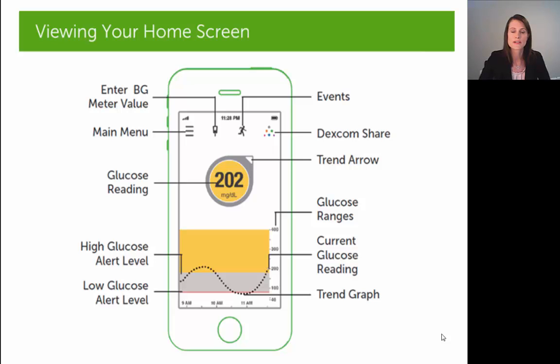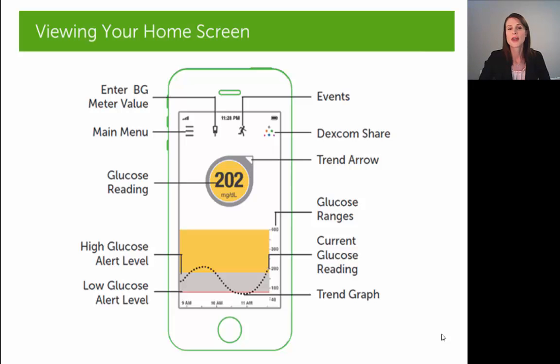In the upper left-hand corner of the G5 app you have three dashed lines representing your main menu, where you can access settings and alerts. Next to that is your glucometer icon, which you tap whenever you want to enter a calibration into your Dexcom system. Next to that is a picture of a person running, representing Dexcom events — where you can enter things like grams of carbs consumed or insulin administered. That information is reported within your Dexcom system for you and your physician to review.